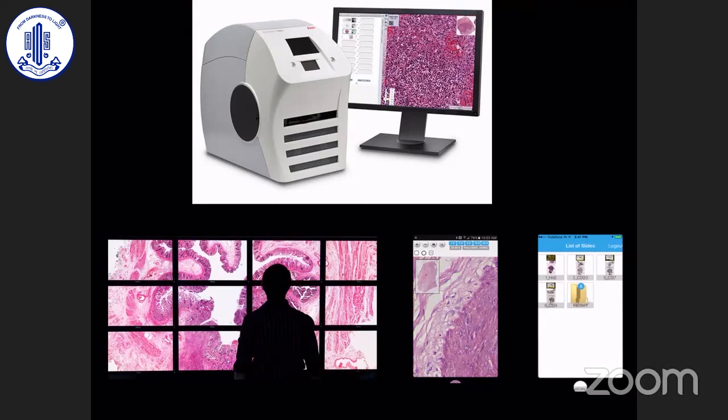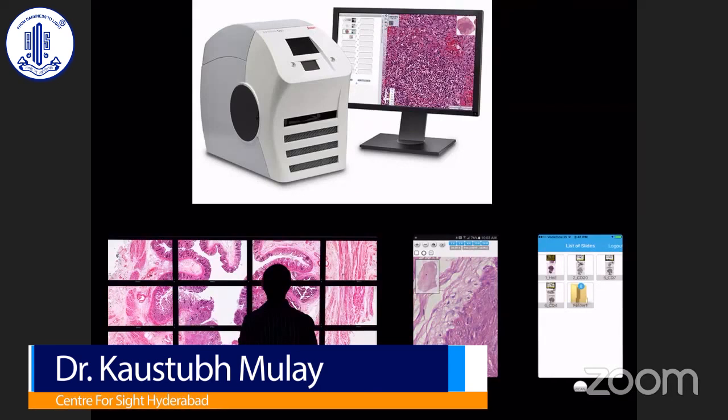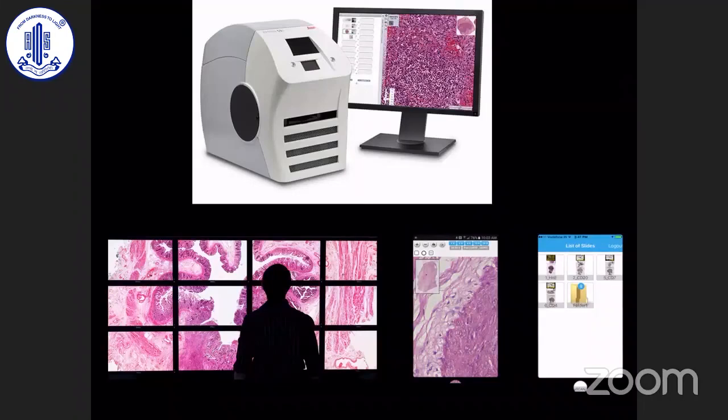Now, sitting in one place, someone else loads a slide somewhere in a scanner. I can always sit at home and make a diagnosis. Now, there are certain data points that are already fed into the computer, which will diagnose it. Now, there have been a lot of studies performed on whether the computer is superior or whether the humans are superior. What do you think it is? Any guess? Well, neither the computer is superior nor the human is superior. It is the combination of the computer and the human that is superior in making a diagnosis. So digital pathology with the human mind is always the best.